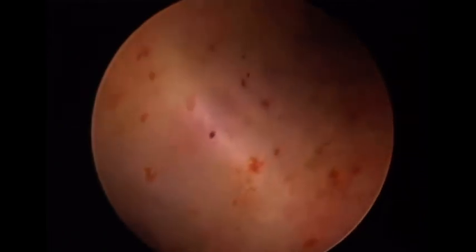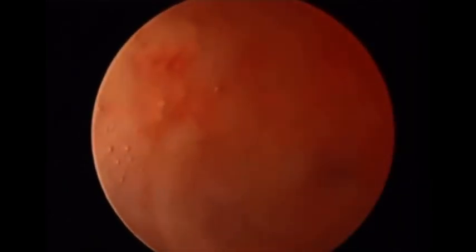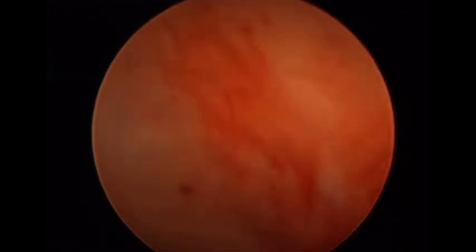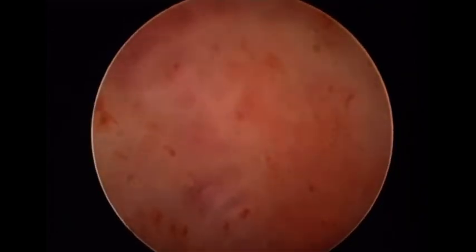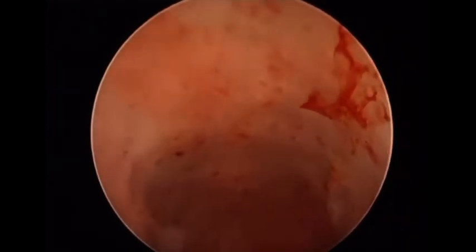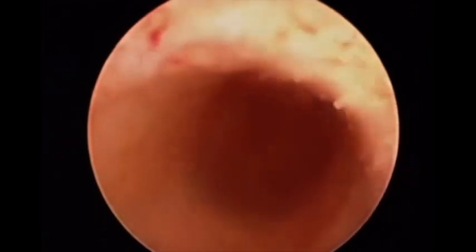Now — that's the septum. You can see that the endometrium overlying the septum is a little different from the rest of the endometrium. Some theories of recurrent abortion relate to defective endometrial covering of the septum. I'm still in the phase of cleaning the cavity — take your time. Hysteroscopy is not just surgery; it's a strategy, planning, science, and mathematical adjustment.